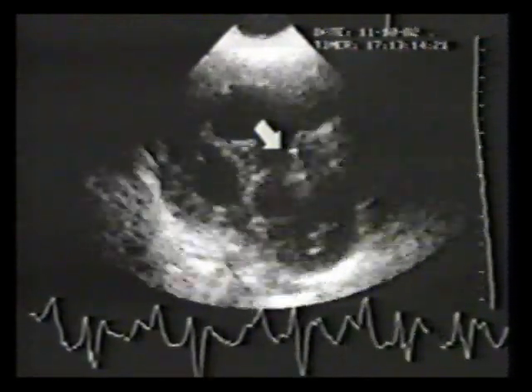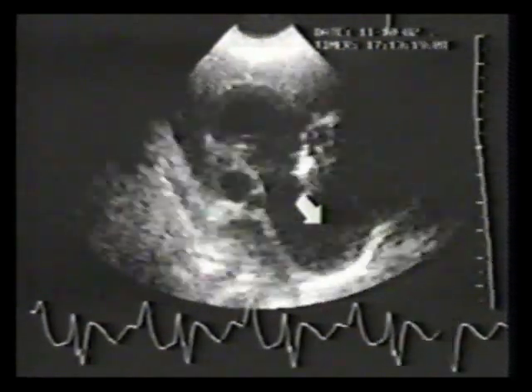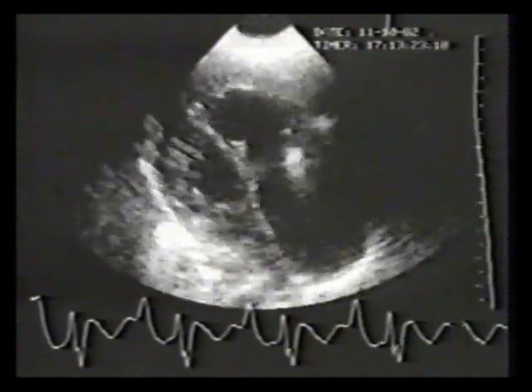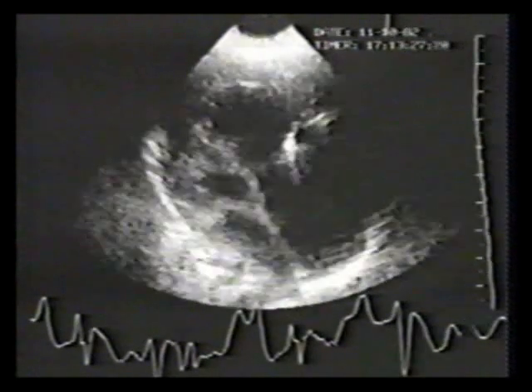In the right atrium, a mass of echoes represents a catheter in this immunologically compromised patient, which had seeded its infection to the tricuspid valve. This child ultimately survived this severe complication.